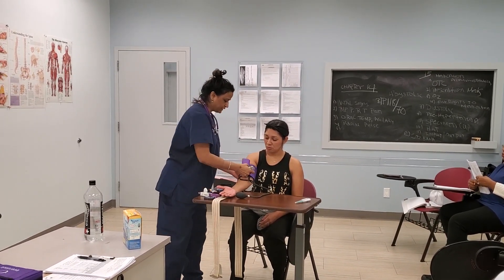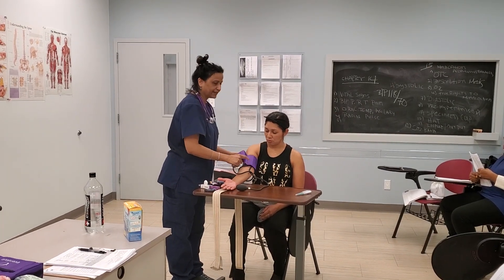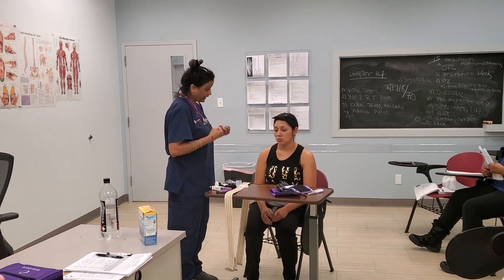Miss Yolanda's blood pressure: her systolic blood pressure is 110 and her diastolic blood pressure is 80 millimeters of mercury. The systolic is when the ventricles contract — that's the upper number. The diastolic is the relaxation of the ventricles when they refill with blood — that's the lower number. Miss Yolanda, your blood pressure is 110 over 80 and it is within normal limits. Inform your patient of the findings and document it in the chart.